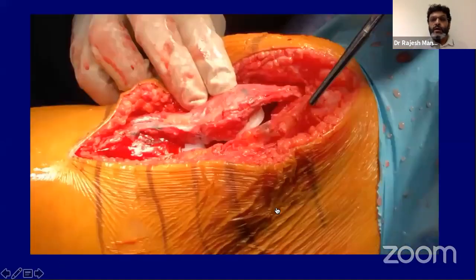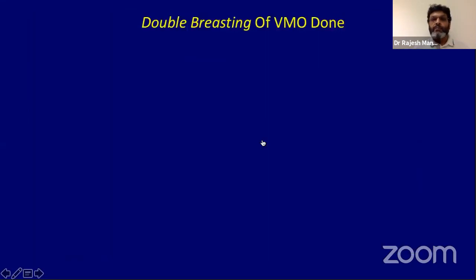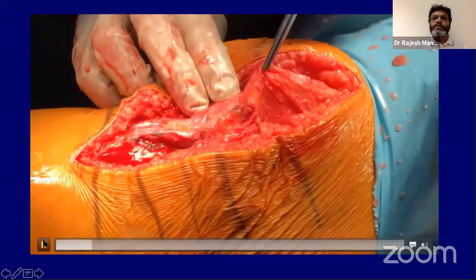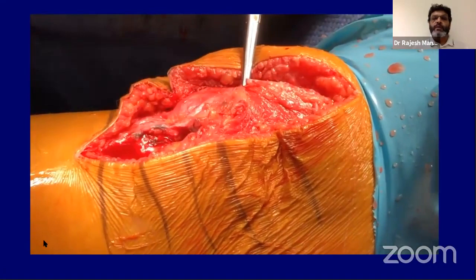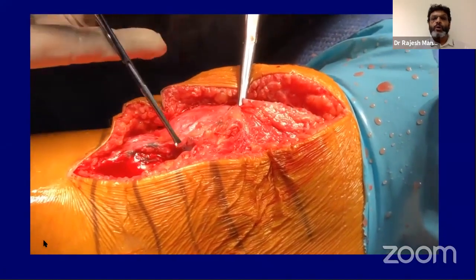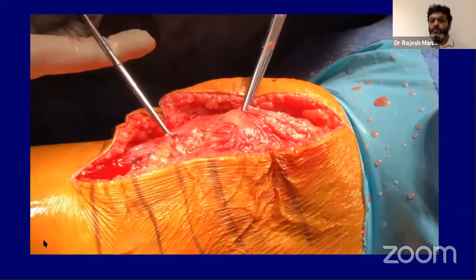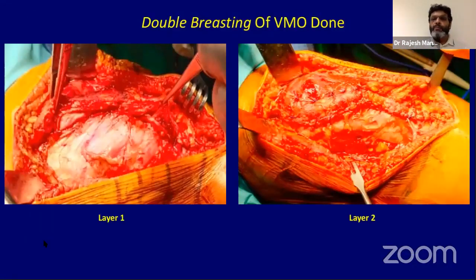And this is what I did. This is the VMO, which you all saw was very stretched out to begin with. I did a double breasting. Let's see if that video will work. Yeah, so you can see that this is the VMO, which was stretched out. I brought it over, not only proximally, all the way distally to the lower end of the patella, and double breasted it to tighten the medial side, and that brought the patellar tracking all the way to grade 1.